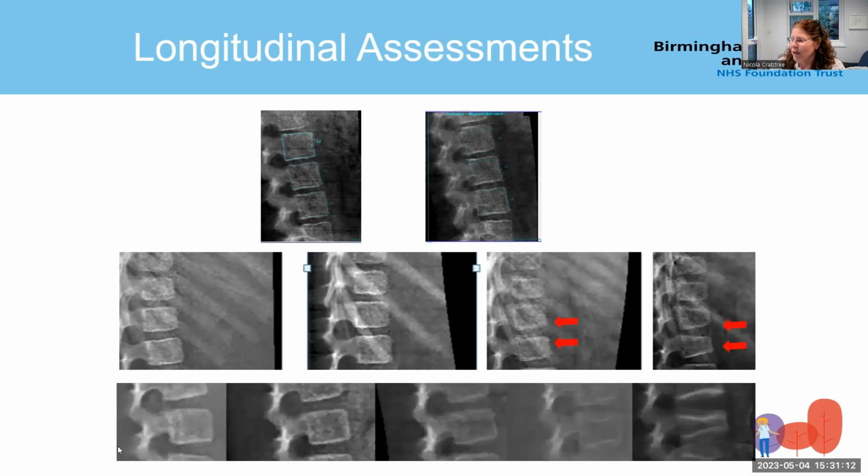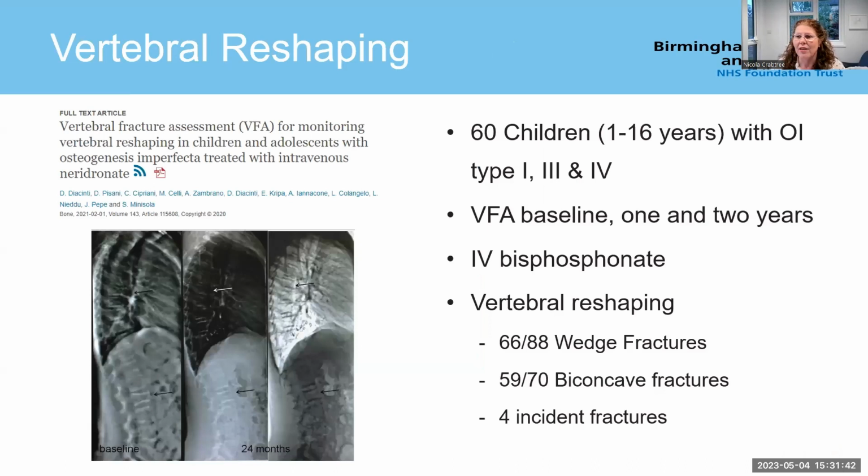Here's another example. So here we can see normal shaped vertebrae, still normal, subtle changes to the end plate, severe vertebral fractures. So the mild changes are important because they very often lead to these more severe painful and debilitating vertebral fractures. So identifying mild vertebral fractures is definitely something we need to try and improve. Another reason for trying to identify fractures early is trying to know when we can best intervene and improve the outcome of these vertebral fractures.